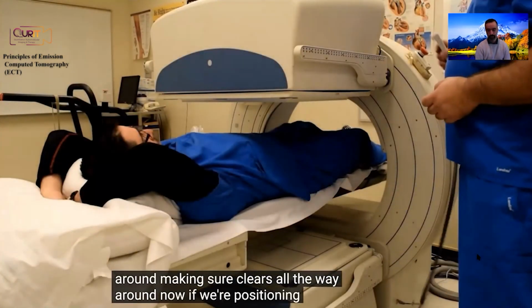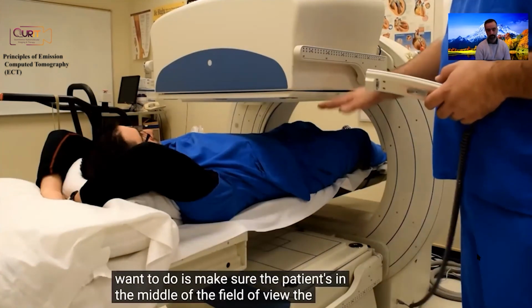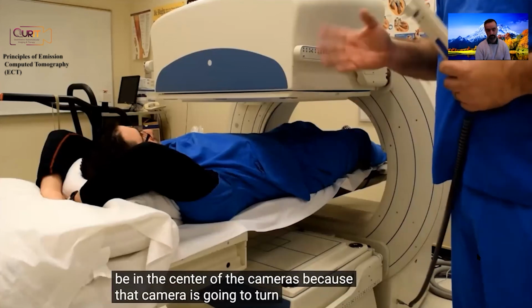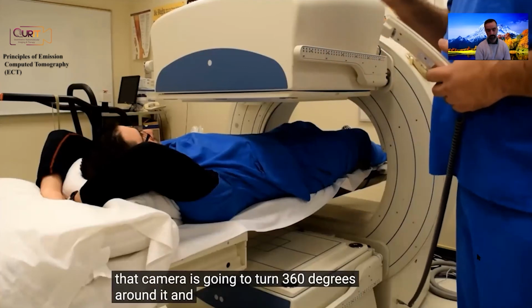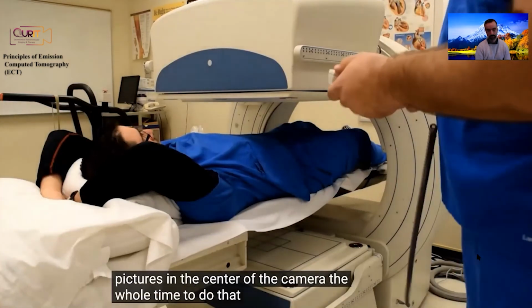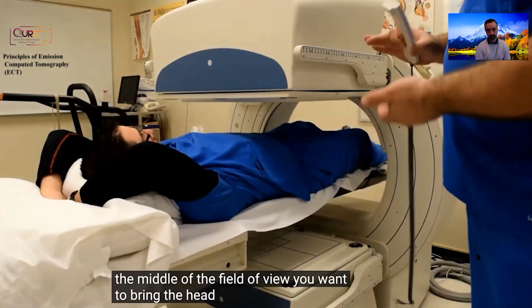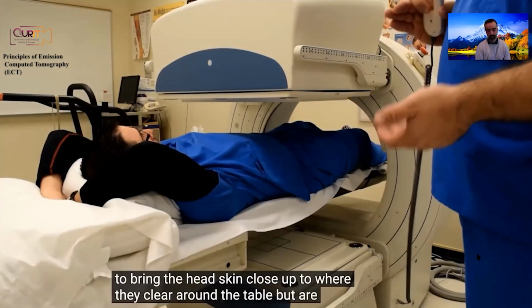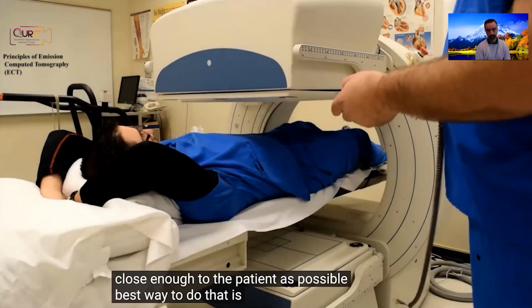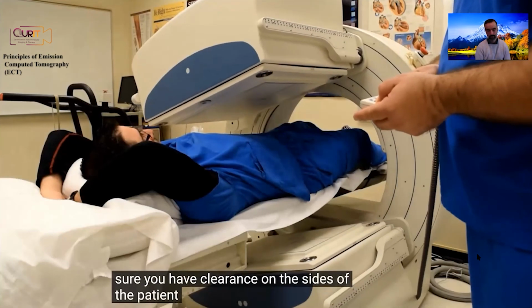Now, for positioning of a SPECT bone scan, you're going to want to make sure the patient's in the middle of the field of view. The bed's up high enough to be in the center of the cameras, because the camera is going to turn 360 degrees around it, and you want to make sure the picture's in the center of the camera the whole time. To do that, you put the bed in the middle of the field of view. You want to bring the heads in close enough to clear around the table, but also as close to the patient as possible. The best way to do that is to spin the camera to the sides to make sure you have clearance on the sides of the patient table.